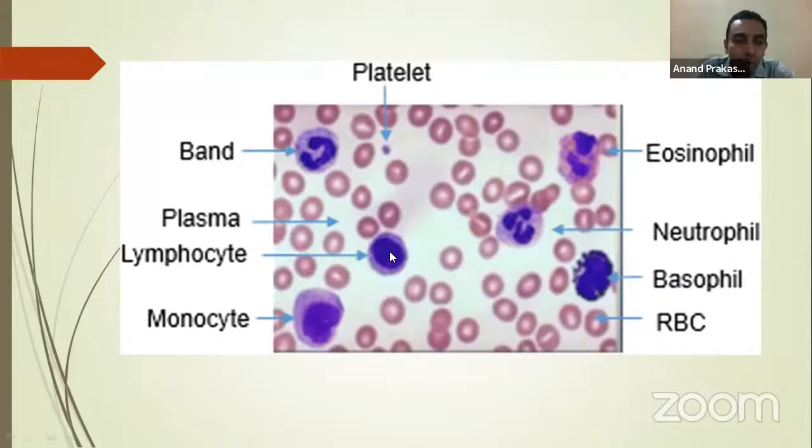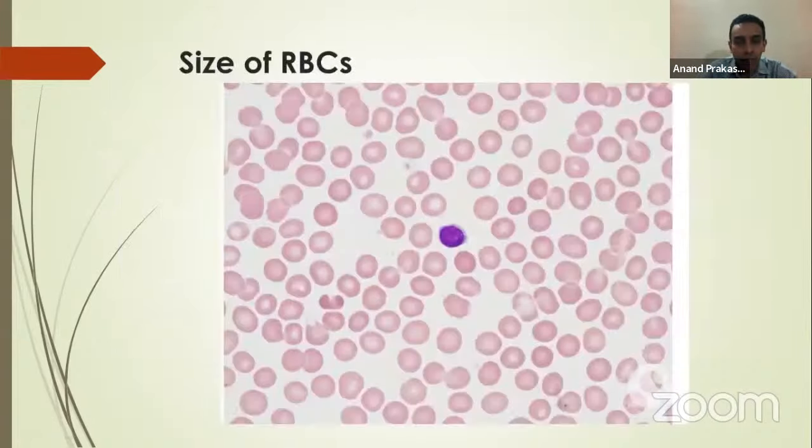I don't have to worry the family and say that, yes, probably we're thinking of leukemia. So clinical picture is very, very important. So this is a platelet, the small speck of cell. Okay, right. So again, a few basic rules.